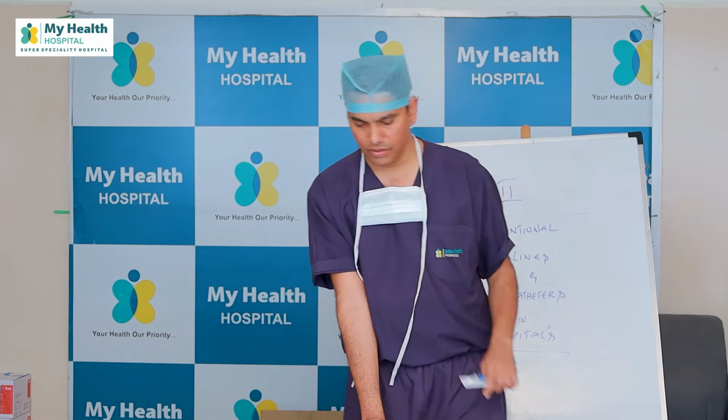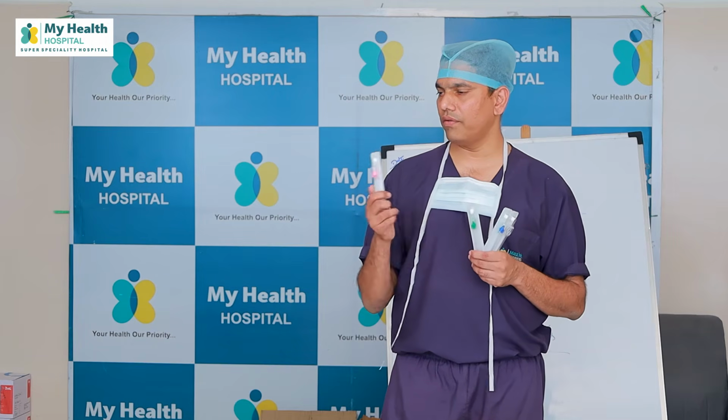To infuse large volume fluids in burns, septic shock, trauma, RTA, when we don't find a cannula, to fix it immediately we'll use a 22, right? At least we need some access, then stabilize and then proceed. How does it matter? What are the sizes here? 22, 18. What does it mean? 18, 20, 22 are different. So it is the caliber of the vein. It is the diameter of the cannula, the maximum flow rate, drip rate that can go through the IV access. When we connect it, what do we connect it into?